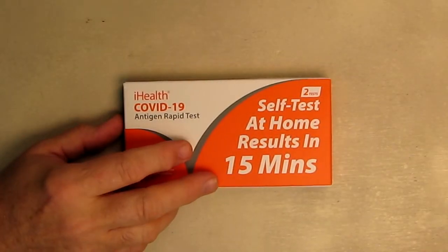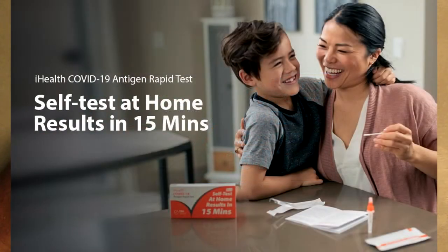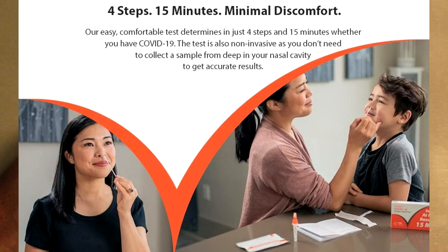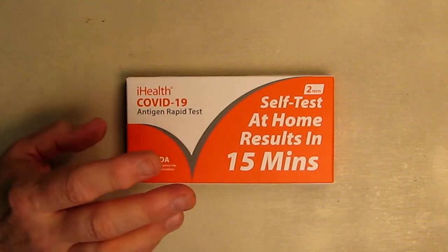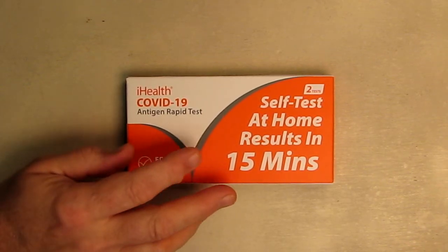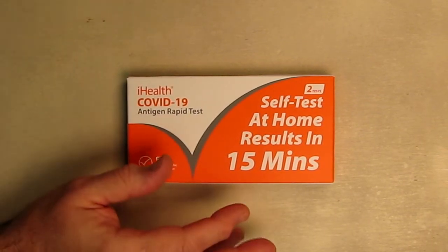Hello again, this is Robert Veach here, and this is my video review of the iHealth brand COVID-19 antigen rapid test. There are two tests per pack. This is FDA EUA authorized, over-the-counter, at-home self-test — results in 15 minutes with no invasive nasal swab, easy to use, no discomfort. I used this for myself and my wife at a Thanksgiving event, and I bought it again for a Christmas event. Everybody in my family has a kit so they're going to test themselves before we get together.